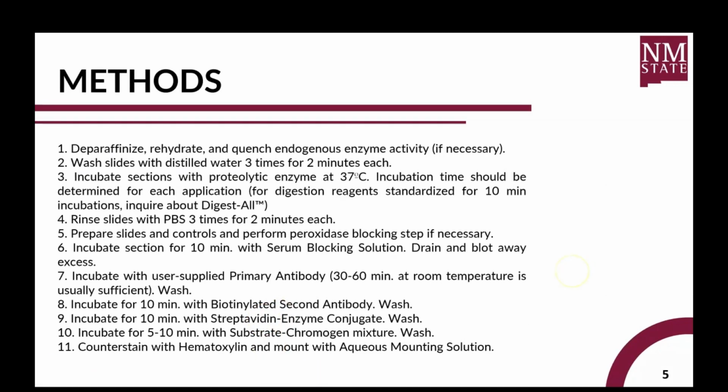For the immunohistochemistry protocol, the first step, if necessary, is to deparaffinize, rehydrate, and quench endogenous enzyme activity. These will all stabilize and prepare our tissue for the rest of the protocol. We then must wash the slides with distilled water 3 times for 2 minutes each time. This will get rid of all the chemicals we used in the previous step.